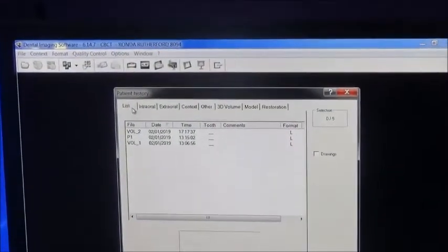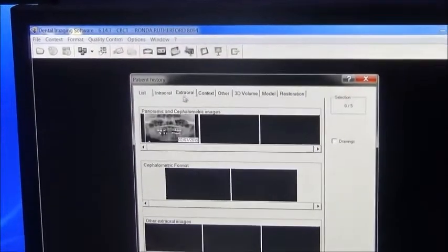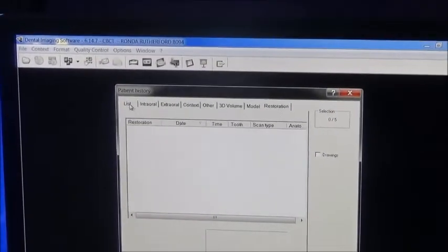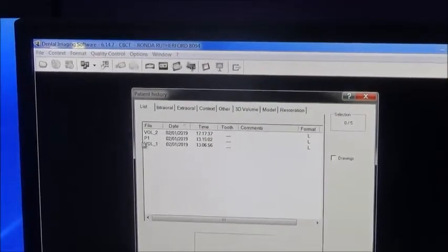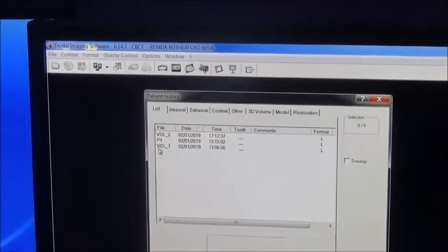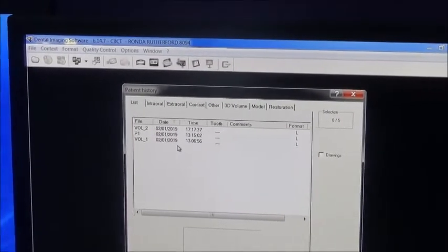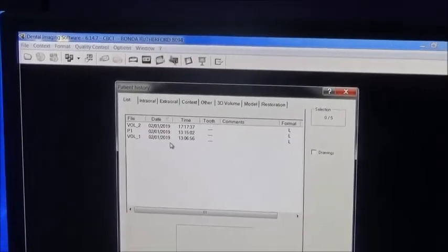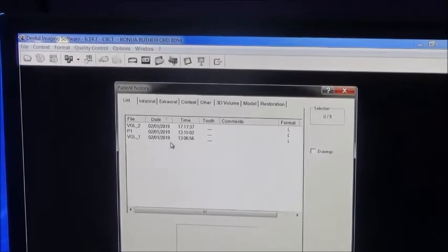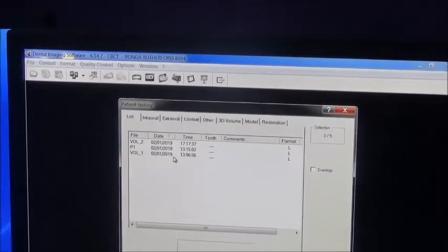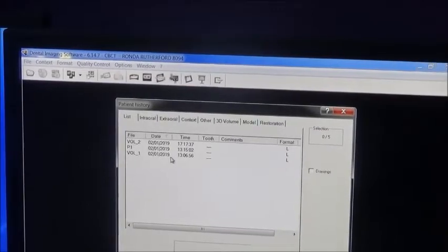Then you click this sign, then the list comes. Here a lot of things are there — you don't have to worry about those things, just click the list. P1 means OPG; volume 1, volume 2 means that is CBCT — CBCT or CBVT, cone-beam computed tomography or cone-beam volumetric tomography.